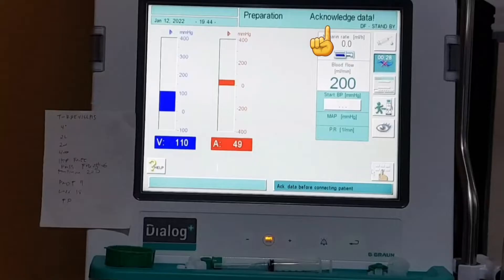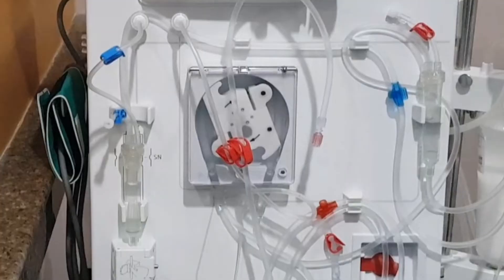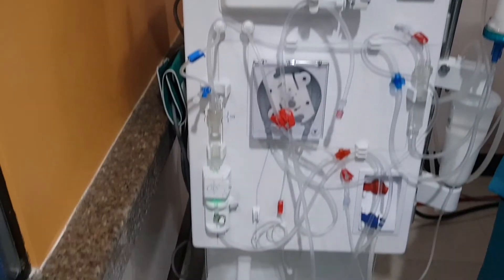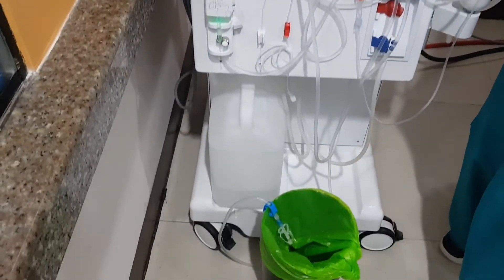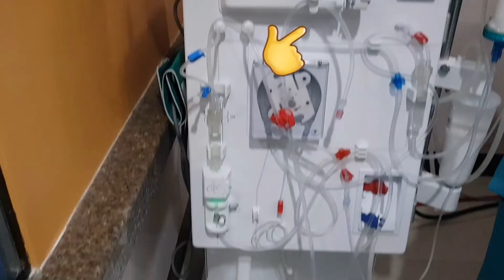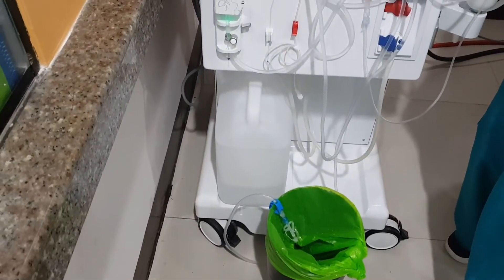Now let's hook this. As soon as the machine shows acknowledged data, lower the blood flow rate to 100 ml per minute. Stop the blood pump. Close the following clamps: venous transducer clamp and the big blue and red clamps. Disconnect the arterial and venous patient's ends. Place the arterial line in an accessible area while the venous line is clipped on a draining bin.